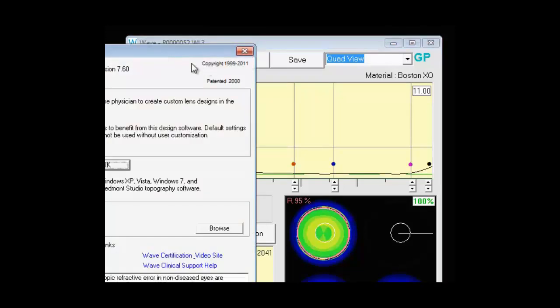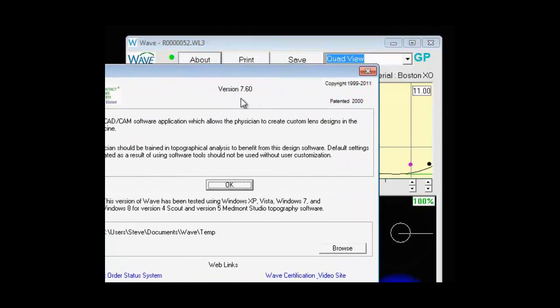Then we have the About button. If you click on that, it will tell you what version of WAVE you're running, as long as the description has some useful links.